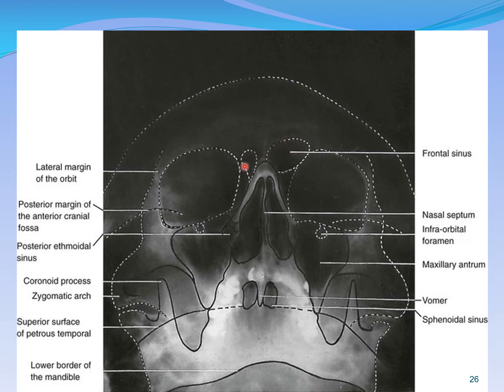These are the frontal sinuses, these are the orbits, this is the maxillary sinus on either side, nasal septum, nasal cavity, you have the ethmoidal air cells here, coronoid process of the mandible, condylar process of the mandible. This is in a closed mouth position. This projection is taken in a closed mouth position.